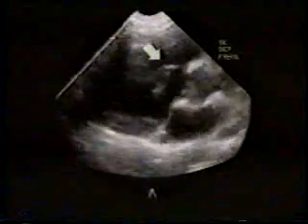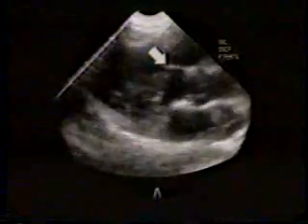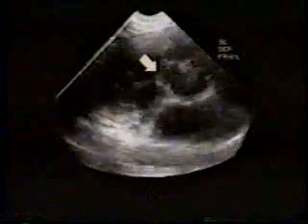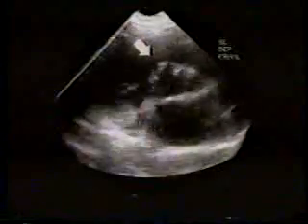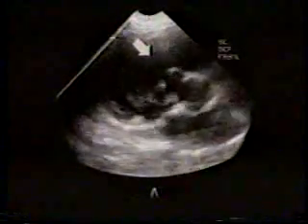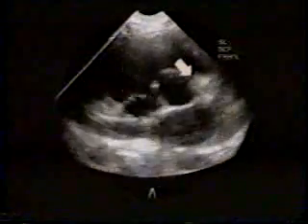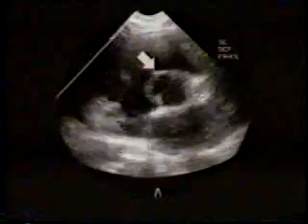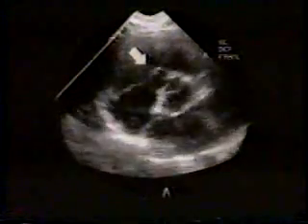You can now see that the aneurysm is partially covering the ventricular septal defect, and there is opening evident right at this position through which residual shunting was still present. Now, as the scan is being rotated into the short axis plane, here's the aortic root with the aortic valve, and a large aneurysm of the membranous septum can be clearly visualized with small residual defect present.